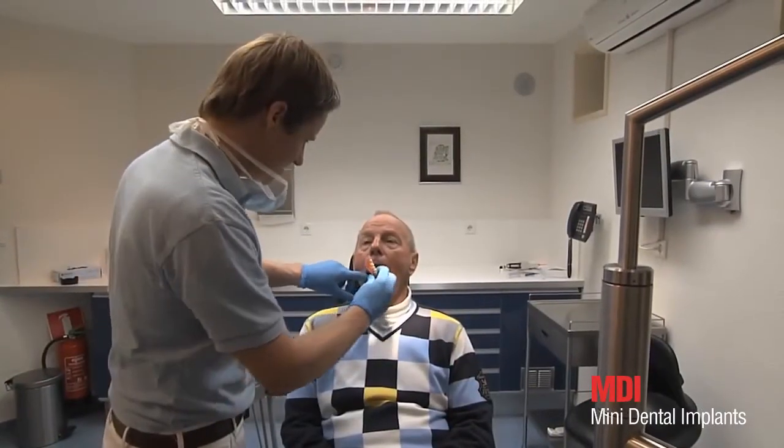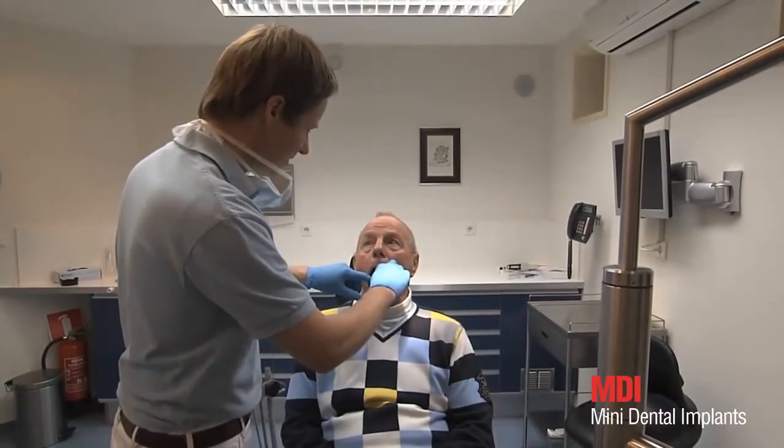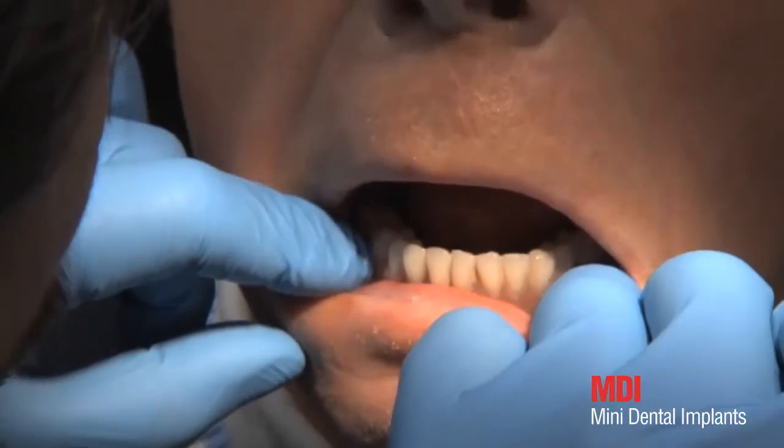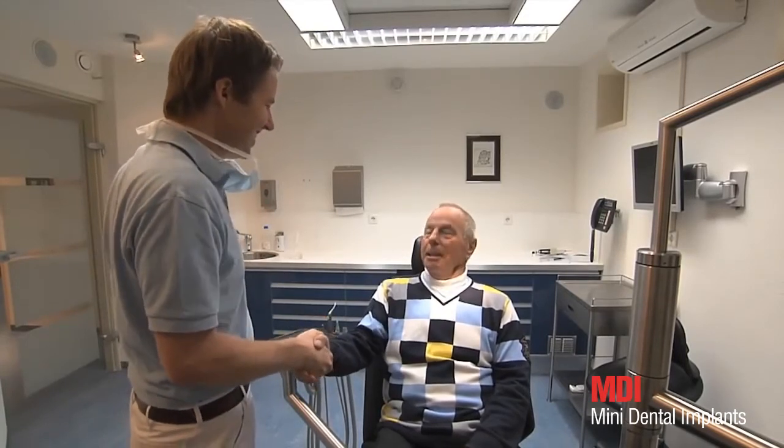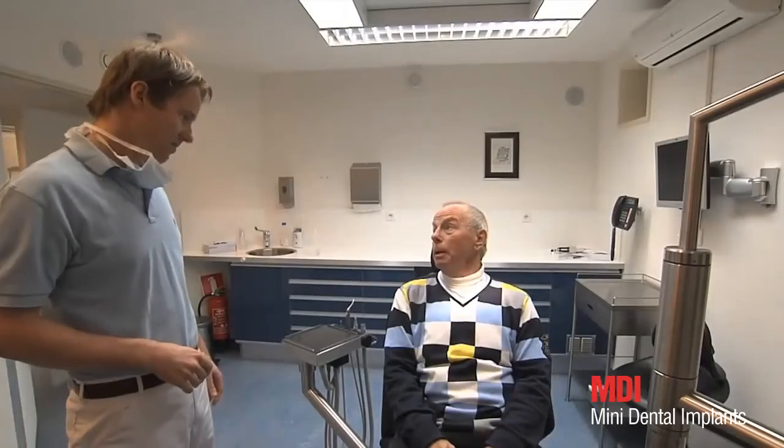The finished prosthesis can now be fitted. Support and occlusion are checked again. The patient has been provided with an aesthetic and highly functional restoration, with minimal surgery and comparatively simple prosthetic measures. Since immediate loading is possible, the patient benefits from an immediate improvement in his quality of life.